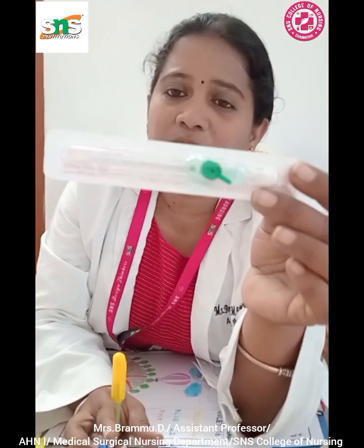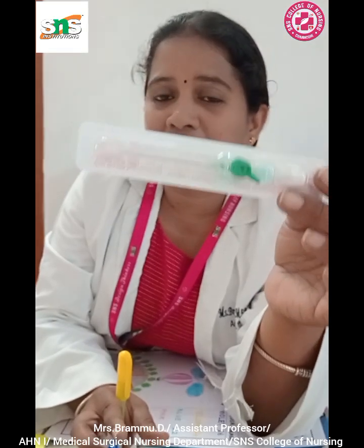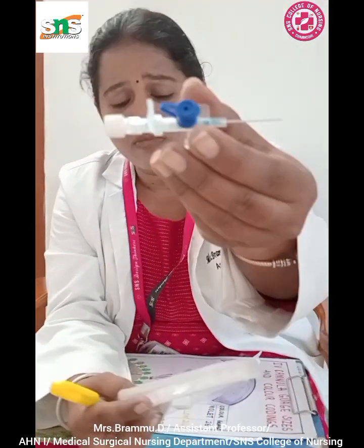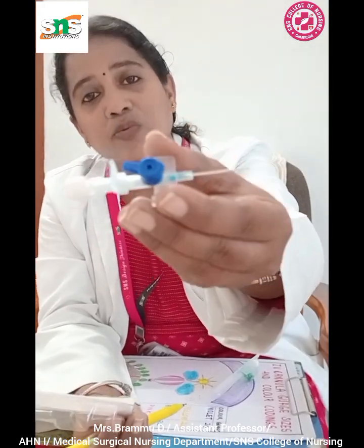Don't worry. There is one mnemonic to keep in mind about the gauges. So what are these gauges? It's nothing but a guide for nurses on how much fluid can be delivered per minute. For example, an 18 gauge needle, which is this needle, can provide 90 ml of fluids per minute. You can purge into the patient's IV line, and it is generally used for blood transfusions or in emergency conditions for rushing fluids. This green 18 gauge Venflon is very essential, compared to the smaller size, the 22 gauge Venflon, through which you can administer around 31 ml per minute.